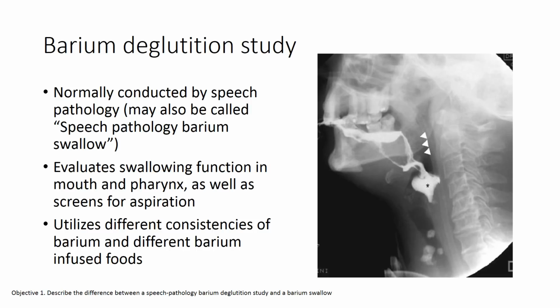Again, there's no real reason to memorize it, or there's no real big teaching point that you need to get from it that I'll put on my test, except just to see kind of what happens, what the swallowing mechanism looks like, and that we can do this down in the Department of Radiology.